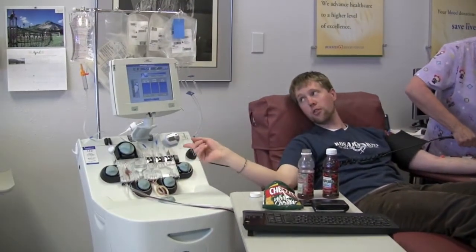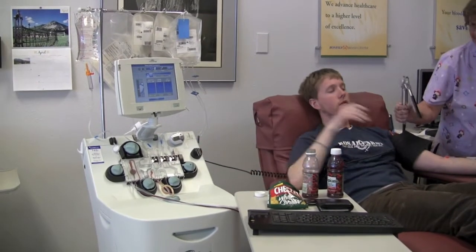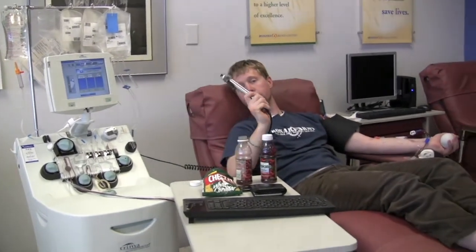As you can see, my blood is starting to go into the apheresis machine and it gets collected in here. It's spun around a centrifuge and they take out all the goodies that they need, whether it's platelets or plasma, and it gets returned to me through these tubes.